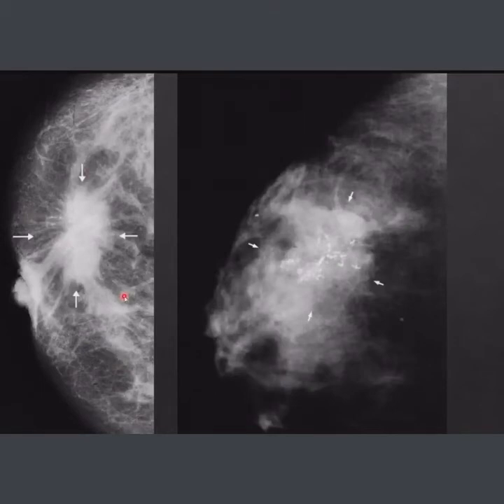This is our straightforward breast carcinoma. In the system we use for reporting, we call this BI-RADS 5, the highest risk of carcinoma. This is a dense mass with a spiculated outline, with spicules penetrating the breast parenchyma and associated microcalcifications. There are strands invading into the skin near the nipple, associated with abnormality and distortion of the adjacent breast parenchyma. But this is our straightforward breast carcinoma.